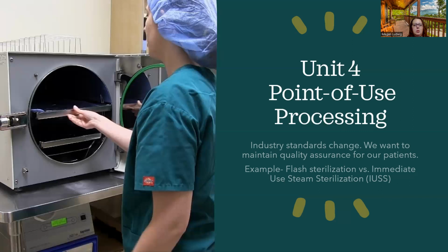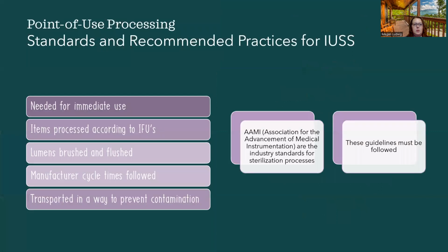Now, we changed the term to immediate use steam sterilization because people were basically abusing the system, so to speak. They were doing the flash sterilization more than they really should have, more than was warranted. So they changed it to something that was only needed for immediate use, and not just because they didn't want to take the time to go through the whole process. So there were studies done on the importance of making sure items were sterilized properly when necessary. So let's talk about some of these point of use processing.